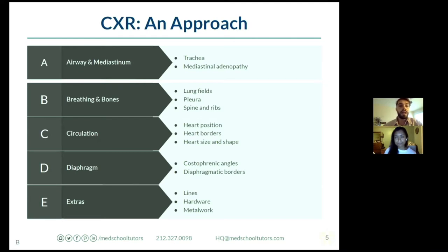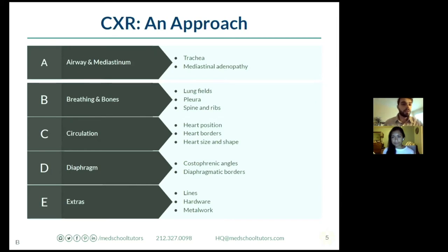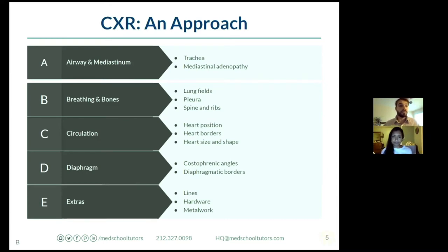When looking at an x-ray, the main thing I'm looking at is: is the airway midline? Are there any broken bones within the lung fields? Are there a normal amount of ribs? Am I getting normal expansion? Then I want to look at the heart - the cardiac borders, my C for circulation. I'm particularly looking for heart failure. That's one thing I really want students to look for.